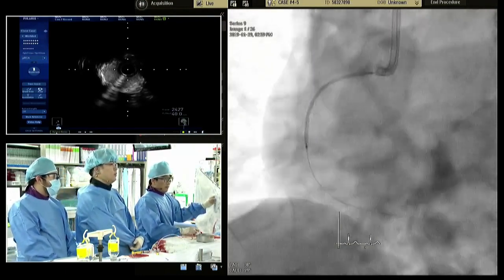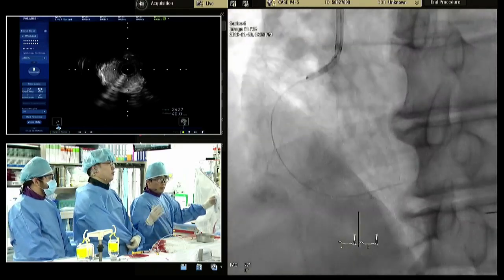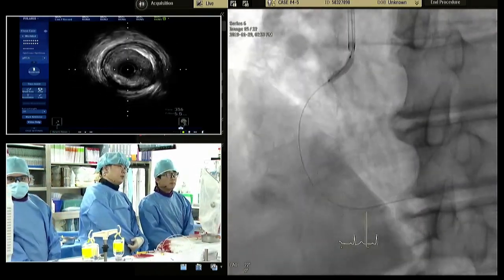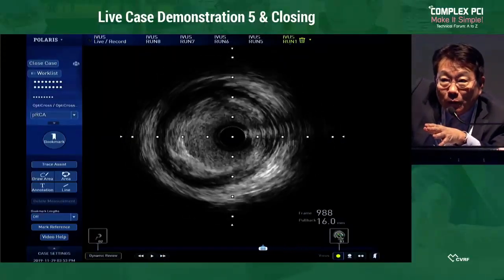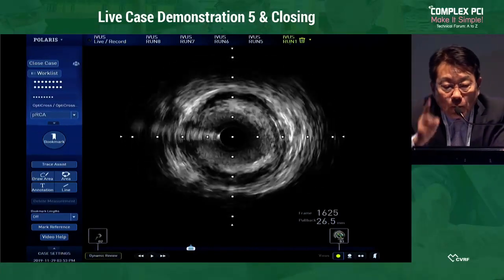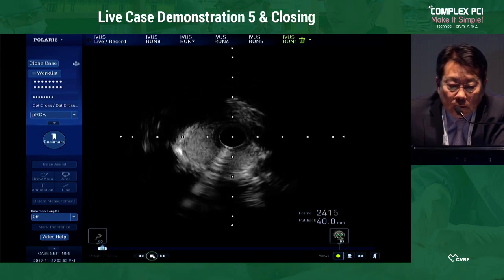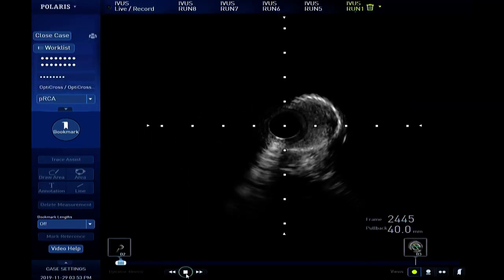Great. So after balloon, first I would like to show you the IVUS finding, the first part. Look at this, it's a pre-image picture. Actually, the wire tip is inside. The guider is not just floating on the outside. We can work the balloon inflation and stent implantation. It is very important to maintain the stability of a right coronary artery, with the wire impact to the distal. Very technical.